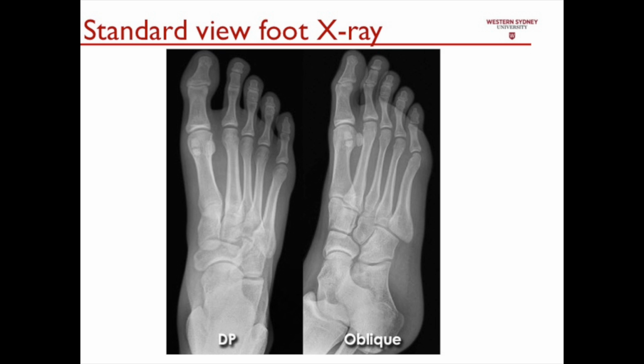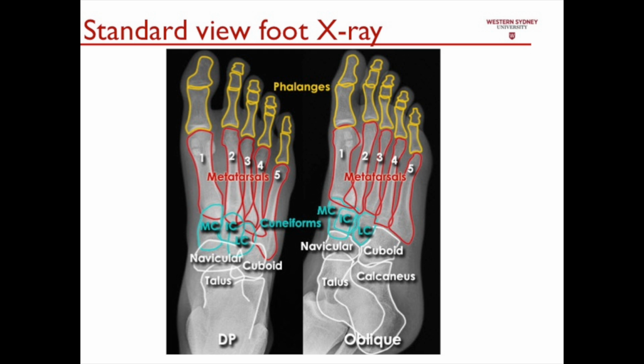Please bear in mind that we may well have specific views of just regions of the foot, which may be restricted to simply the forefoot or midfoot. And it's important that you would have the precision in terms of your request when you would be sending a referral through. This is the same image as you've seen in the previous slide.